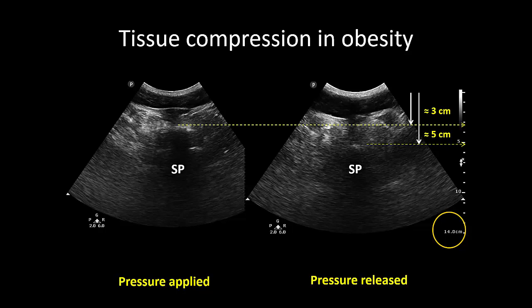If only the spinous process is visible, depth can be estimated based on the fact that the average adult lumbar spinous process is approximately 4 centimeters tall. So in this patient, depth of the lamina is at least 9 centimeters, and a needle that is longer than the standard 90mm one will be required.